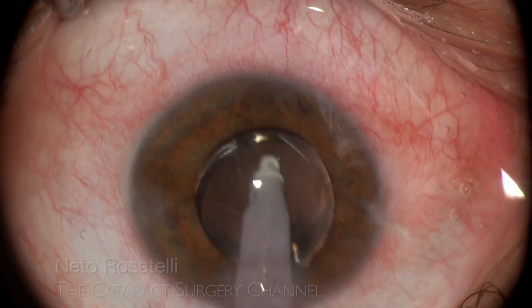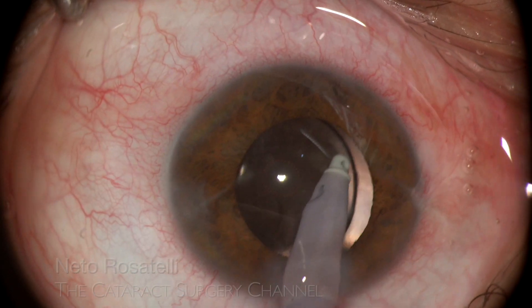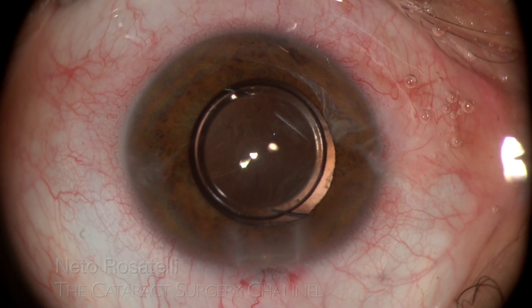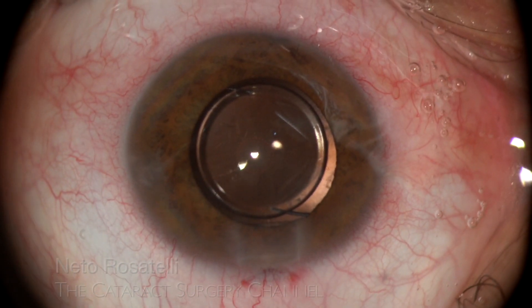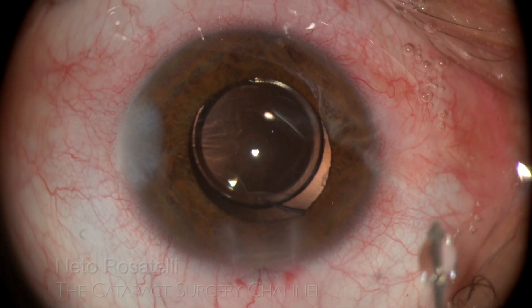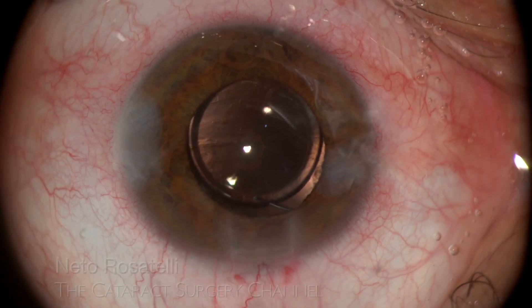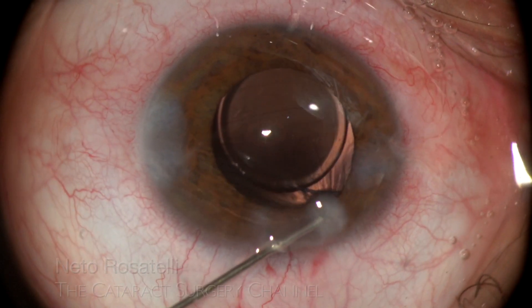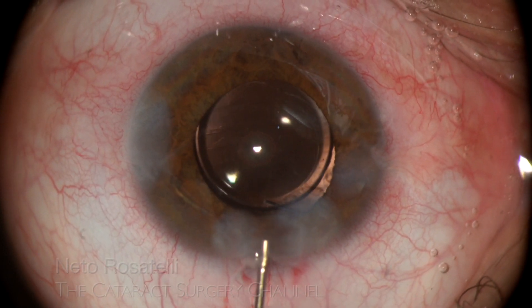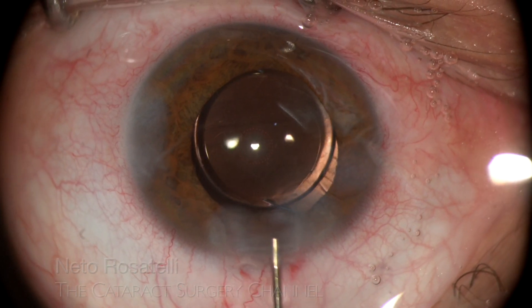I prefer to avoid going under the IOL, doing a gentle rock and roll on the IOL to dislodge OVD from under it. The key in these traumatic cases is to be as gentle and careful as possible, aiming to preserve remaining zonules so that an in-the-bag IOL implantation is achieved. IOL centration is evaluated and stromal hydration seals the incisions. Hydration of the main incision's roof is necessary to achieve a good seal.